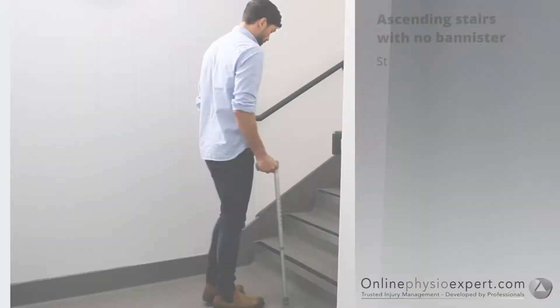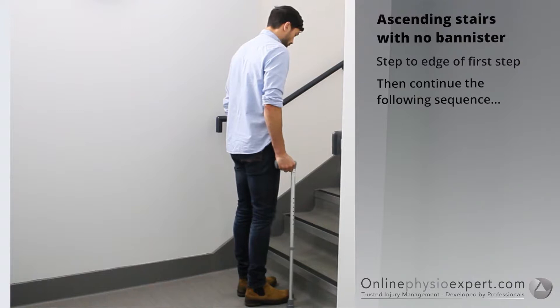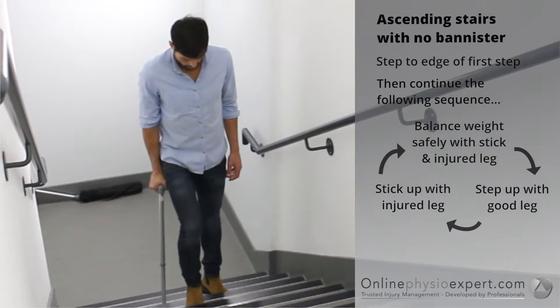To ascend stairs with no banister, step your feet to the edge of the first step. Find your balance point through the stick and your injured leg. Step your non-injured leg to the next step, followed by your injured leg and the stick. Repeat these sequence of movements until you safely reach the landing.